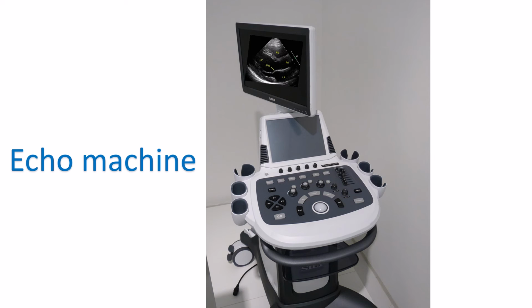The echo images and videos can be saved to a DVD, digital versatile disc, or pen drive as well for transfer to another computer. Modern echo machines can also be connected to the hospital information network using LAN, local area network cables, so that physicians can view the echo images and videos on computers in their office as well. A picture archiving and communication system, PACS, can also be used in the hospital for storing and retrieval of echo information.